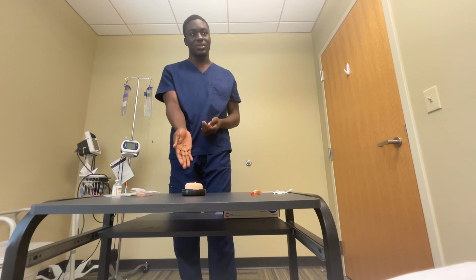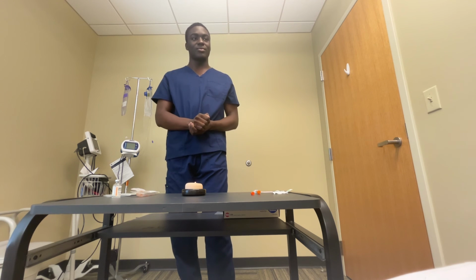And then I will document my procedures and annotate how it went, and then annotate the dimensions of the wheal and how the patient tolerated it. And then I am done performing my intradermal injection.